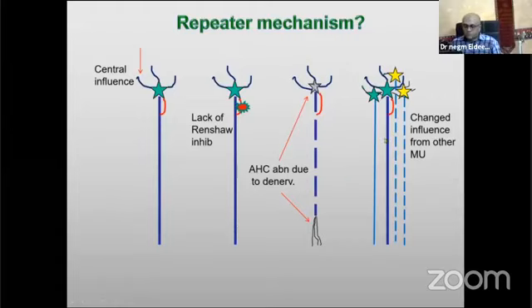And finally, we also have the situation when we have lost other neurons and our main neuron is still intact. If we have lost a lot of neighbors, they in many cases provide inhibition to this neuron. So if we lose inhibition because of loss of neighboring neurons, then this one can become influenced and give extra F responses.